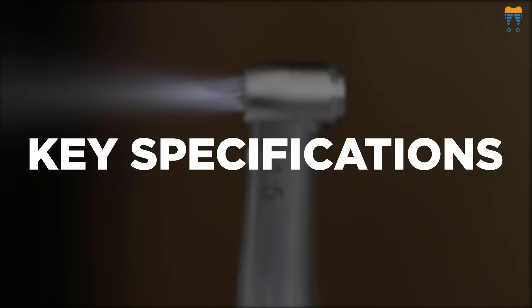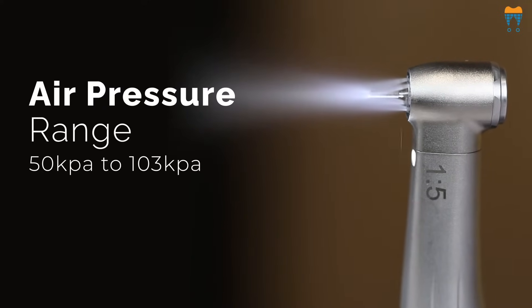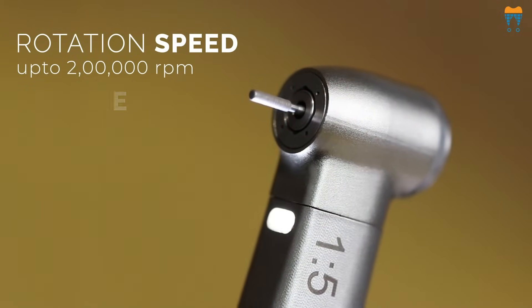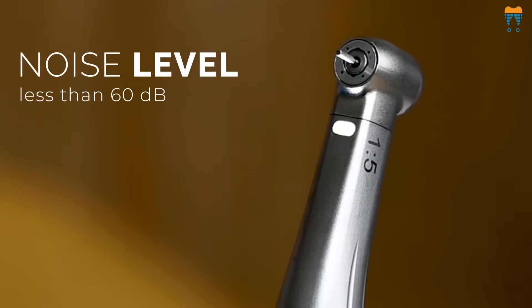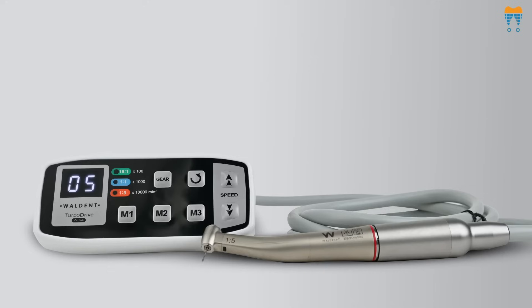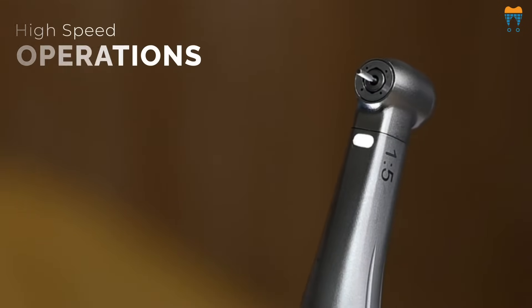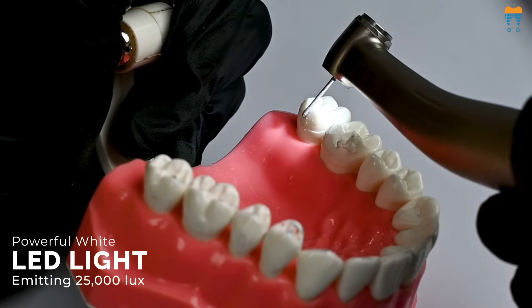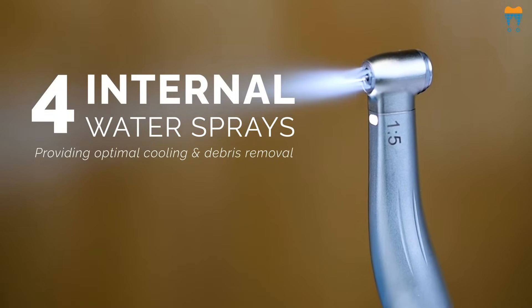Let's delve into the key specifications. Adaptable to an air pressure range from 50 kPa to 103 kPa, capable of reaching up to 2 lakh rpm of rotation speed, and offering a torque of 3.4 Ncm, operating at a noise level of less than 60 dB. The motor's lightweight design at just 71 grams. The electric motor comes with the 1 Ratio 5 Increasing Handpiece, which enables high-speed operations and comes with a high-quality ceramic bearing, powerful white LED light emitting 25,000 lux, and 4 internal water sprays providing optimal cooling and debris removal.